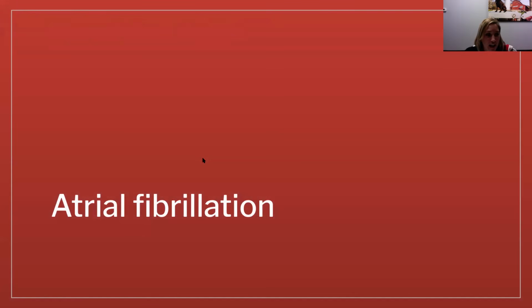Okay, so if there are not any questions on normal sinus rhythm, we'll go over atrial fibrillation. And if there are questions, just unmute yourself and ask me, because I don't know where the chat went. I probably won't see it in the chat. Okay, atrial fibrillation.